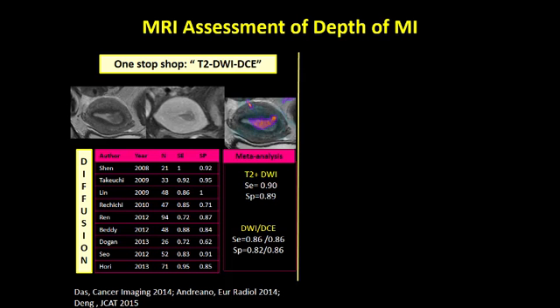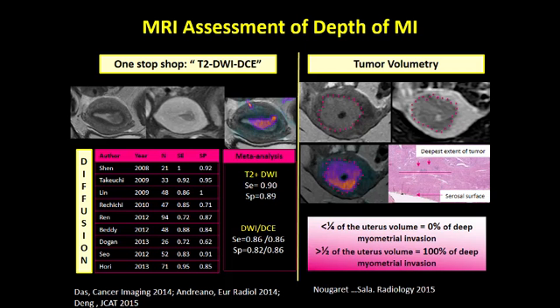And actually, I am a strong believer that if you did supervise your endometrial cancer staging on your MR scanners and you got nice diffusion-weighted images, you really don't need to give contrast. But if you don't supervise them, then it's better off to actually give contrast because you don't know if the diffusion images are actually good enough.